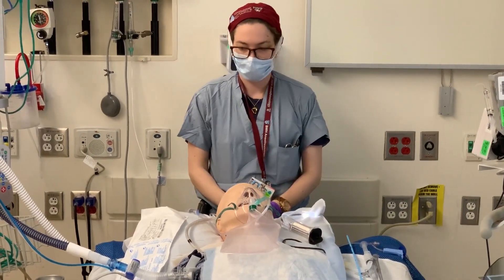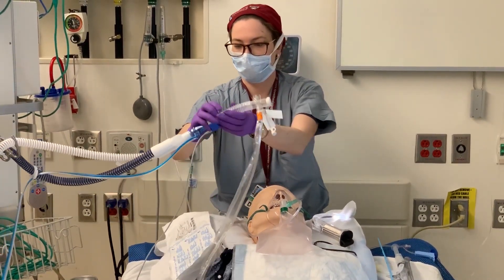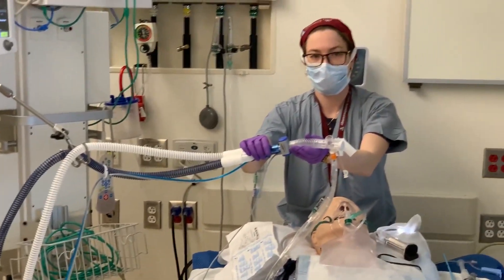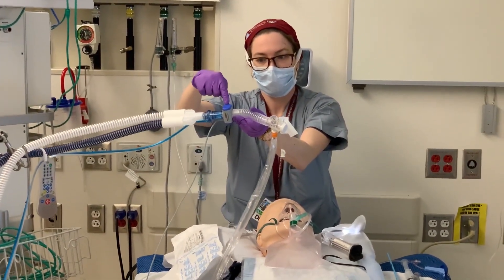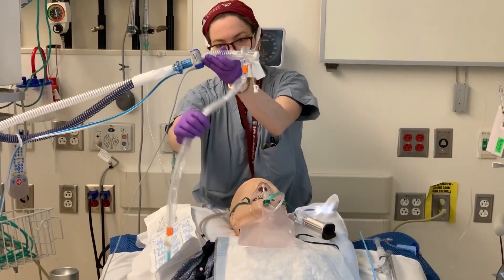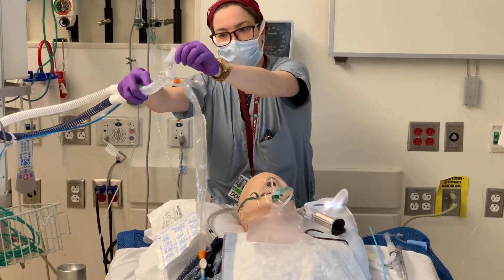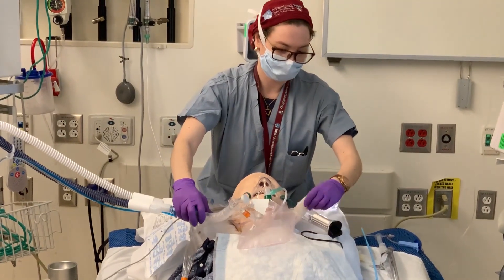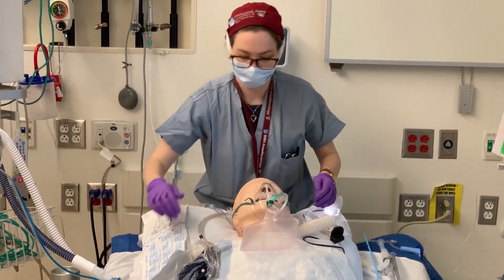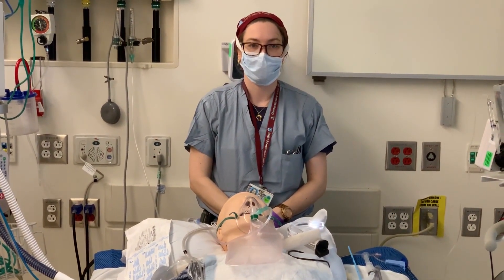The ventilator circuit should be nearby. Confirm the necessary components with the respiratory therapist: a HEPA filter on the expiratory limb, inline infrared capnography calibrated by the RT, and closed inline suctioning attached. The ETT securement tie is in place on the end of the circuit and the Comfit tube is secured behind the patient's head. The OG tube with lube should be provided by the ICU nurse, and there should also be an AMBU bag with HEPA filter connected to oxygen but not on.